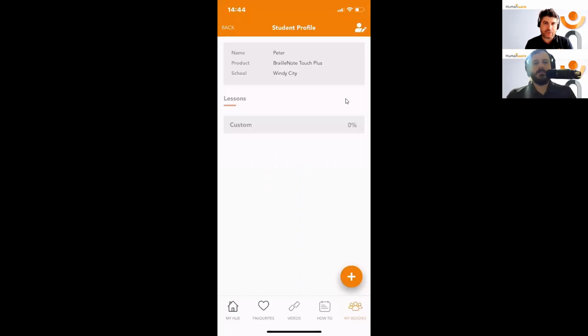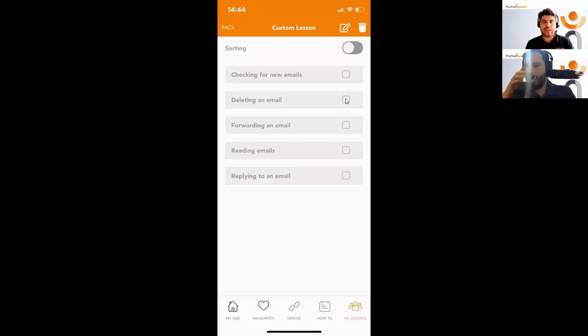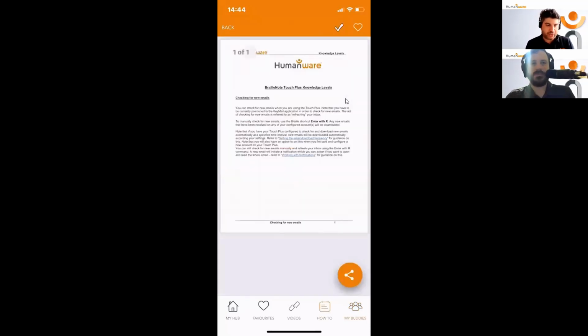Okay, so we now have the custom lesson followed by the percentage, which is 0, of course. Let's go into that custom lesson by pressing the custom lesson, and that will open up all those relevant guides that I've just selected. So again, we can click on checking for new emails. That will open up that relevant guide.